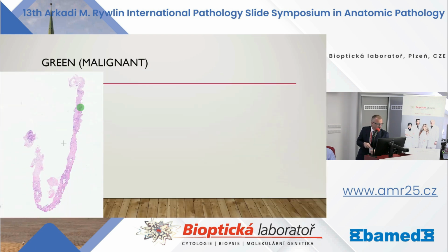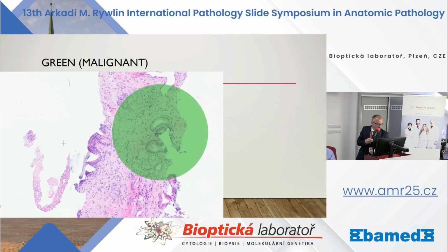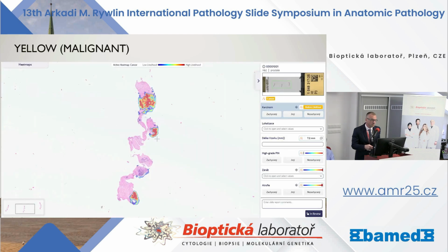Or like this, you get a large needle biopsy with just one focus. It's a slightly suspicious gland. You see just one line of cells, a little bit of blue mucin, maybe some nuclei, but nothing more. And in immunohistochemistry, carcinoma.